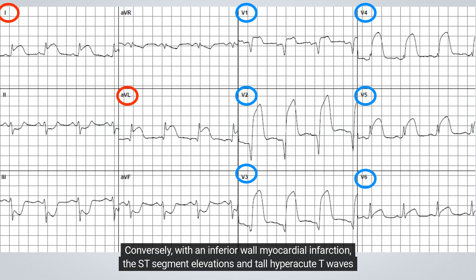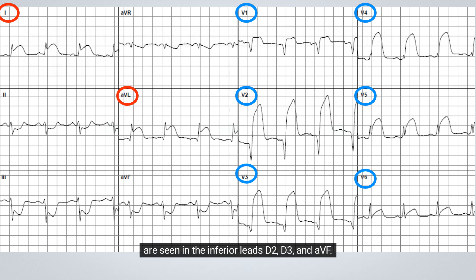Conversely, with an inferior wall myocardial infarction, the ST-segment elevations and tall hyperacute T waves are seen in the inferior leads D2, D3, and aVF.